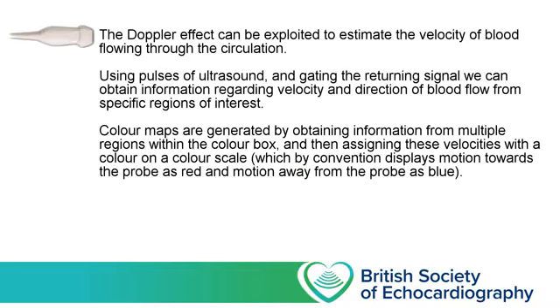So that just about wraps it up for this lecture, and I think we'll just finish by reviewing what we've covered today. So in summary, when we fire ultrasound into our patients, we can get information about the timing and amplitude of a returning signal, but also by assessing the frequency shift or phase shift, we can get information about whether or not the reflective structure was moving towards or away from a probe.